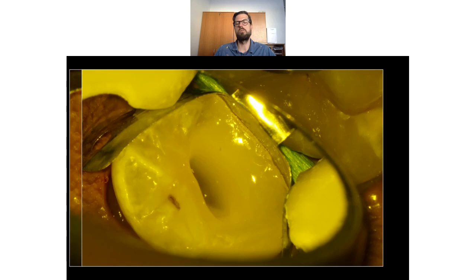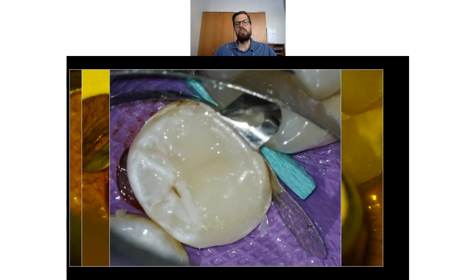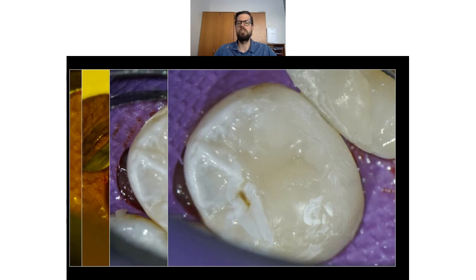You just continue with the second bottle. So not the primer, but the adhesive of the Optibond FL, it's like a bond, it's like flow, and you just put it, you put some light on it, and you can continue. So for me, no problem. The harder thing is to have no moisture as you elevate the margin. So you will finish with your restoration, and this is the final result. You polish it, and this is a magnification of about 12, so it's really, really big.